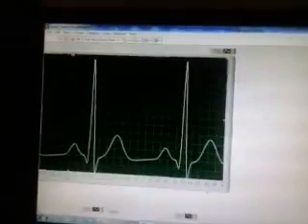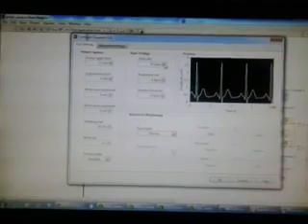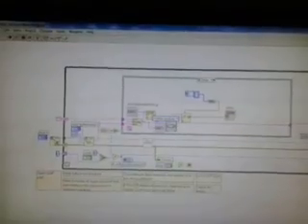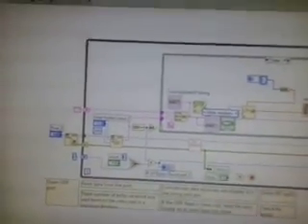We are converting the data into the nearest integer value and the decimal integer string that is sent using this server UDP protocol. And as usual, we convert this to a basic heart rate of about 72 to check the proper functioning. Then here it is. Run the server. Coming to client. This is a block diagram of client UDP protocol client side.